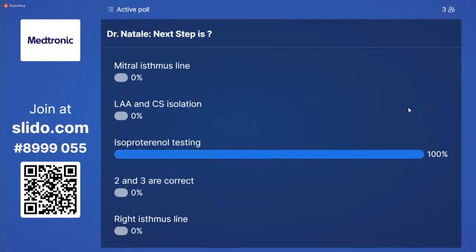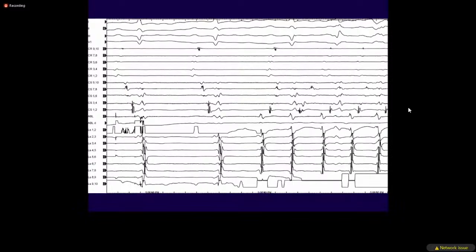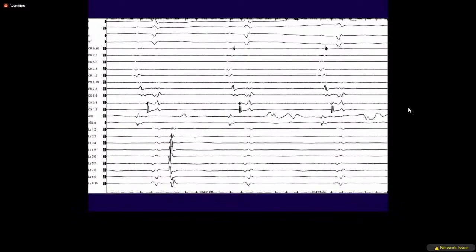Okay, good. So again, in this case you should be familiar with the setup. You have Crista, CS, appendage, and you see again another appendage trigger. Then you see it stop and then restart as we start the ablation. And then eventually, after isolation, you have what we call dissociated firing, which you see in the pulmonary vein and we see in other areas. It's actually much more common in the appendage than around the pulmonary vein. Usually it's slow, as you see here.